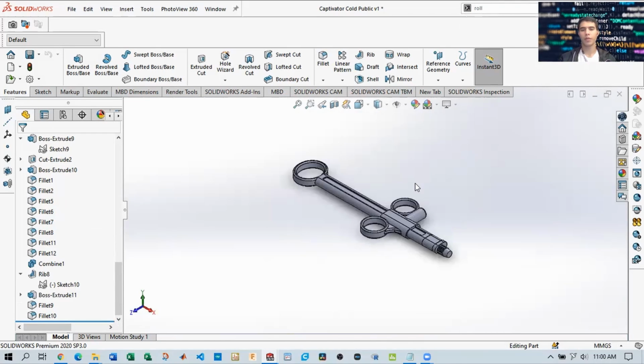What's left? We've incorporated the handle so far. We're missing the actual shaft, or the thread, or the wire.